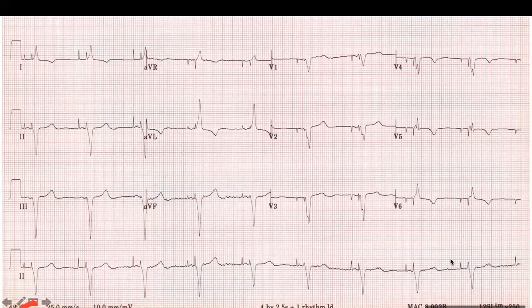So for the atrial sensing, as we said earlier, there has to be an intrinsic atrial activity, and then we'll see how the device behaves on it. At least for now, there is no evidence of intrinsic atrial activity, and there is no evidence that the device is behaving inappropriately to noise, for example. So we can't comment on sensing, but there is some atrial loss of capture. As for the ventricular lead, there is a pacer spike and QRS, pacing QRS till the end of that. So there is good capture, but I can't really comment on the sensing.